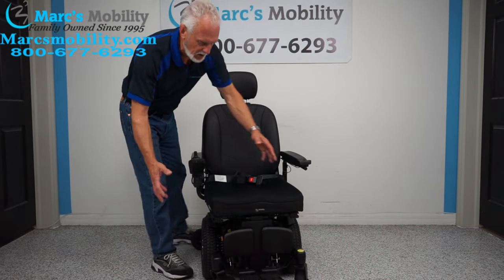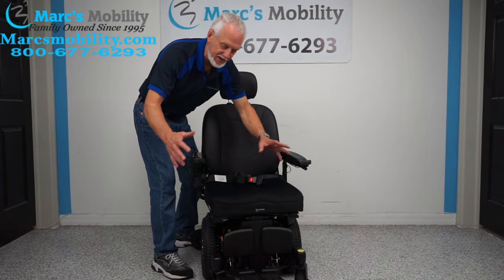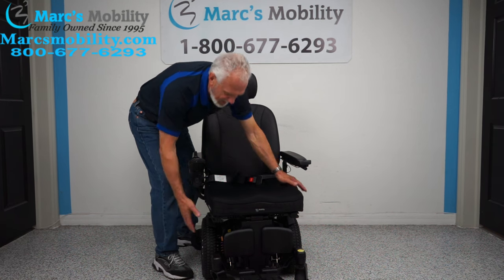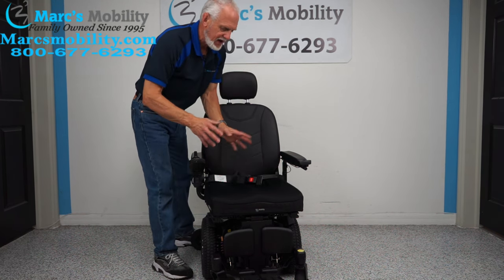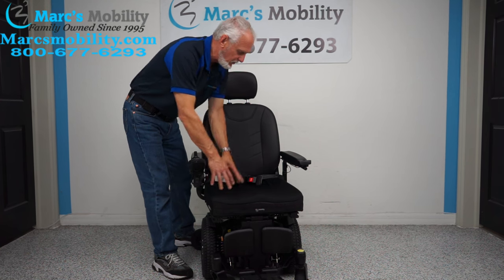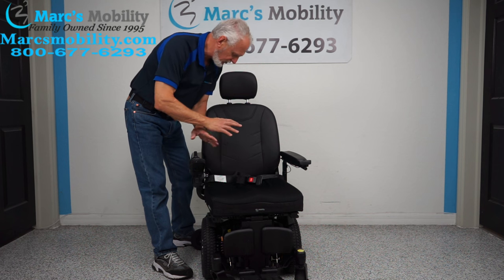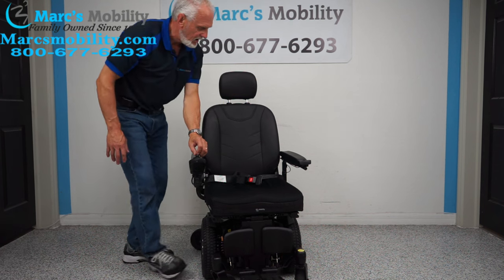So this is a small power chair. I don't want to say it's extra light — it's a little bit smaller than medium. It only has a small base and a real short turning radius. It has a decent size seat though, and we're keeping the seat on this chair. So this is going to make someone a perfect chair if you don't need anything like tilting or reclining.